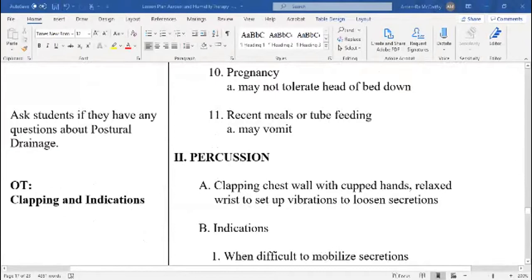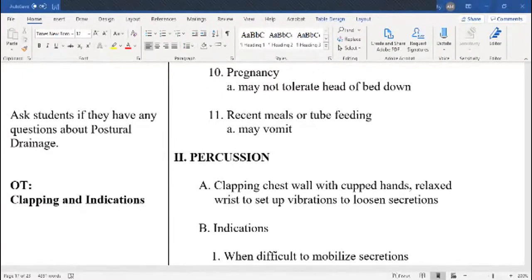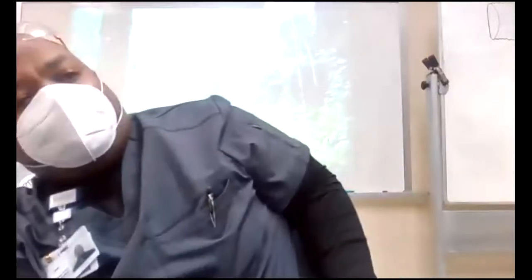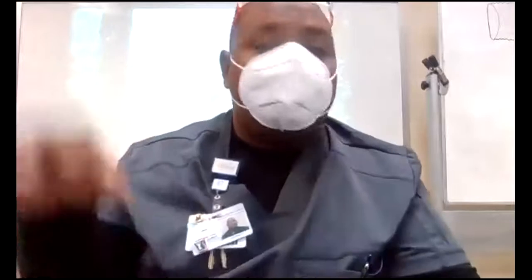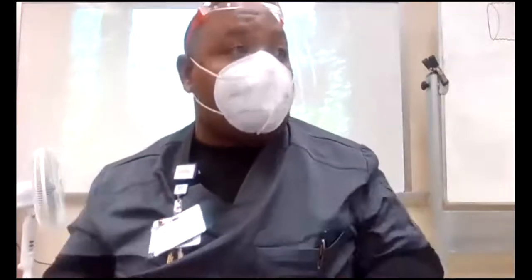Now, once I got you in that position, now what am I gonna do? Called percussion. Now that I got you in that position, I can percuss on you to help get it on out of there, right? It's draining, but it might not drain fast. I'm gonna help the drainage, okay? So if I got you on your side and I'm trying to drain that lateral segment, then I will have my hands cupped like this and you use your wrist, not your arms. You don't smack, but you use a cupping motion. We also have devices that do this, but we have a percussor. If you don't wanna use your hands, you can use a machine, vibrator, percussor, a chest vest to shake the whole body, right? We can do a lot of different things to get this stuff off you, okay?